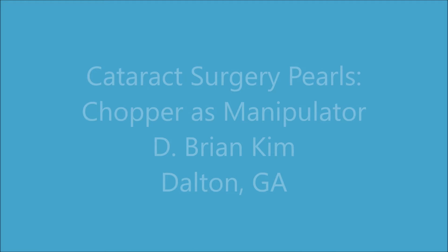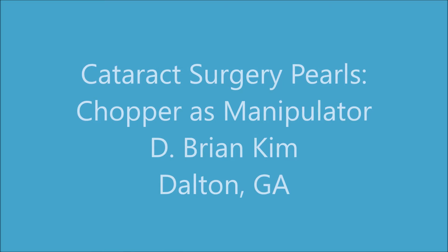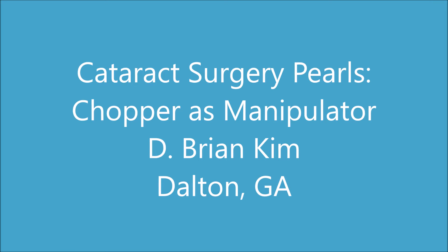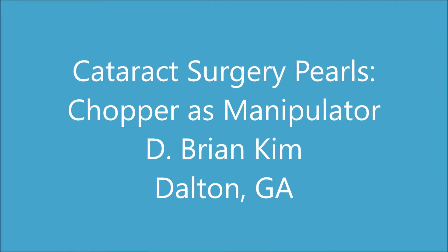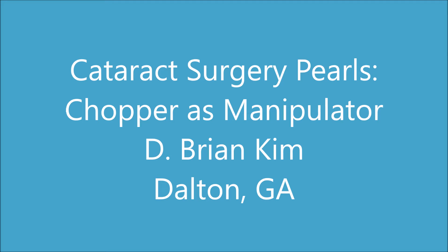Hi, this is Brian Kim. I'd like to share my pearls on using the chopper as the manipulator. Using the phaco tip to grab and roam within the capsular bag is unsafe because you can snag the iris and the posterior or anterior capsule. The phaco tip can only function as a grabber using phaco, aspiration, and vacuum, which is uncontrolled. The chopper, on the other hand, does not have any of those issues and you can freely go close to the iris and capsule without fear of damage.